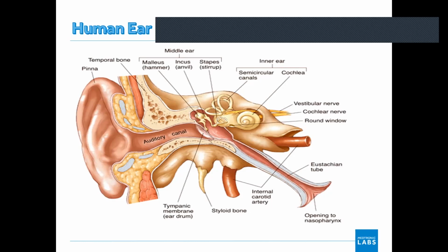So we can see the impression of the malleus bone in the tympanic membrane. If we capture the image of the tympanic membrane, you can see the handle of malleus. That impression we call the handle of malleus, right? Once the sound wave hits the tympanic membrane, it starts vibrating. Then the vibration transmits to the malleus, because the malleus is connected with the backside of the tympanic membrane. If anything is connected with a vibrating medium, then that thing also starts vibrating. The same thing is happening here.